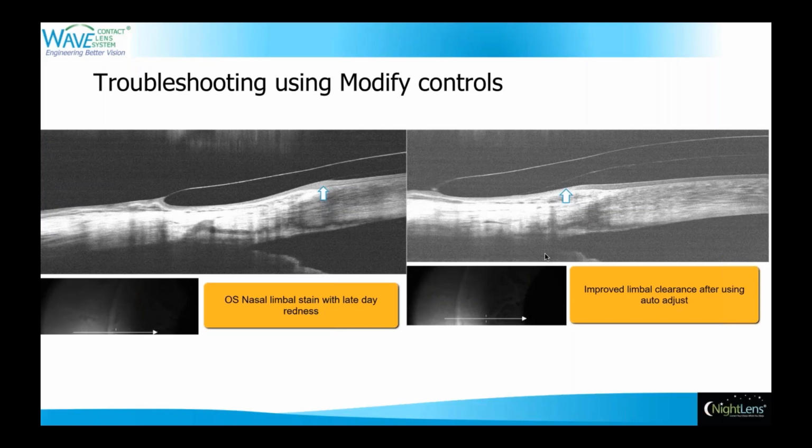for these patients. This is a patient that was referred to me by a friend, an optometrist who runs a dry eye clinic at a very large ophthalmology clinic in Atlanta. And he just had done everything he could for her to mitigate her dry eye symptoms and suggested she come out and try scleral lenses. So the first lens on the left, you can see we've got some hypertrophy there of the limbal epithelium. You're looking at the left eye nasal area there.